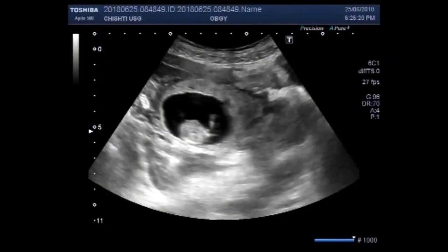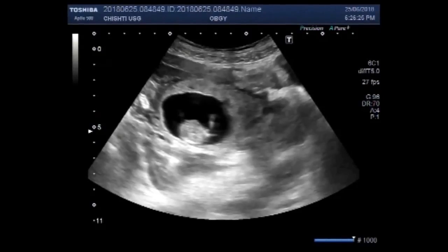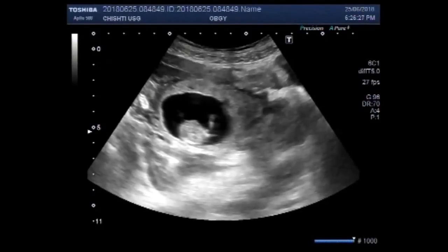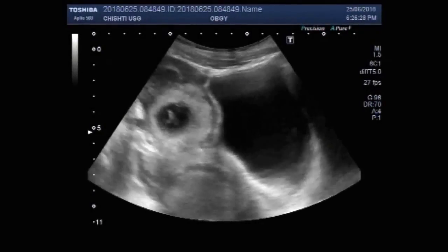Dear viewers, I hope you are all fine. This ultrasound video shows an ectopic pregnancy with an alive fetus.